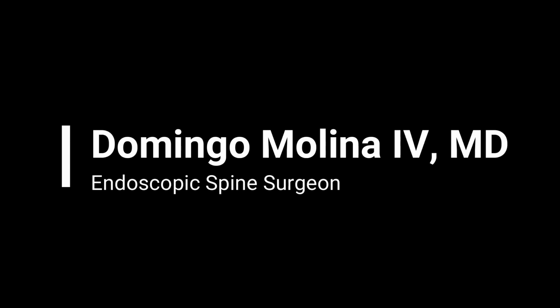I'm Dr. Domingo Molina. I'm an endoscopic spine surgeon. This is a right L5S1 transforaminal discectomy. We will be discussing indications and technique. We'll save targeting and localization for another video.